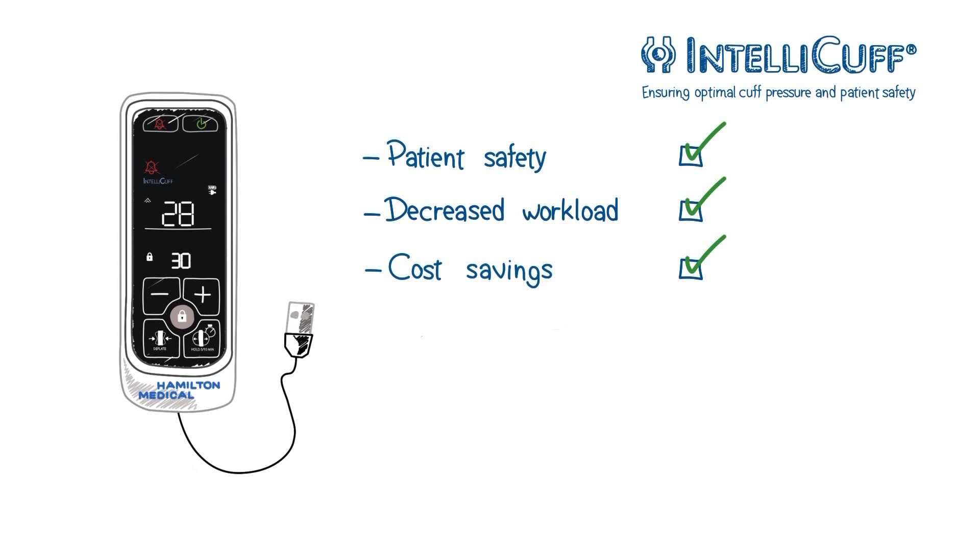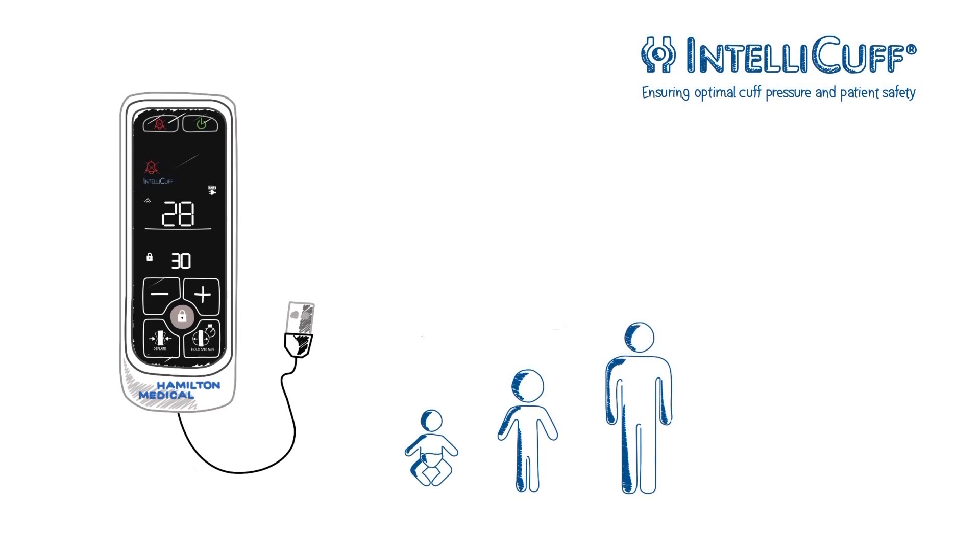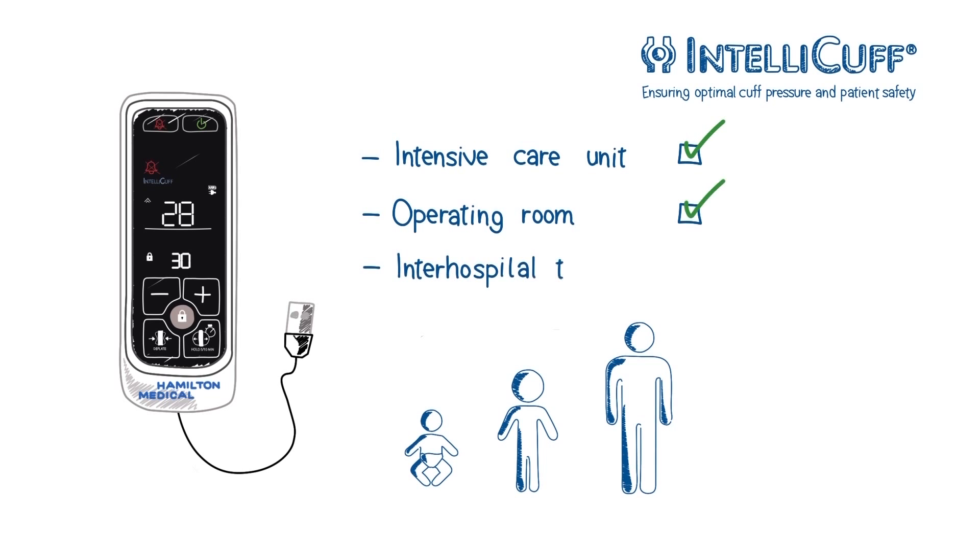IntelliCuff continuously measures and automatically adjusts the cuff pressure during mechanical ventilation of neonatal, pediatric, and adult patients. It can be used in intensive care units, operating rooms, and during inter-hospital transport.